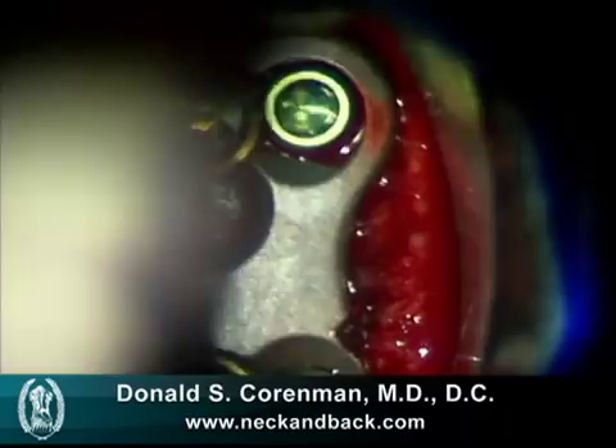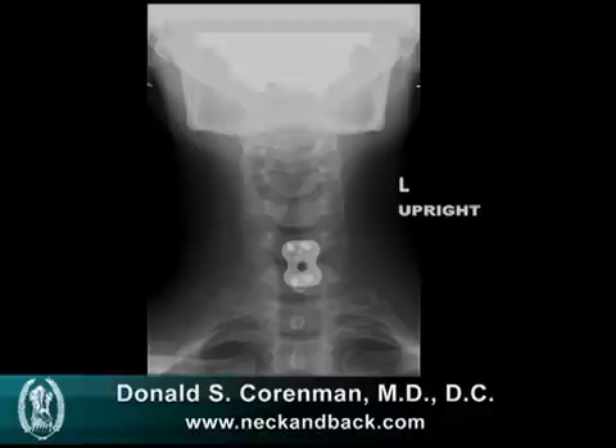That is the post-operative x-ray in a front-to-back view and a side view, noting the position of the plate and the incorporation of the graft. Thank you for your attention.